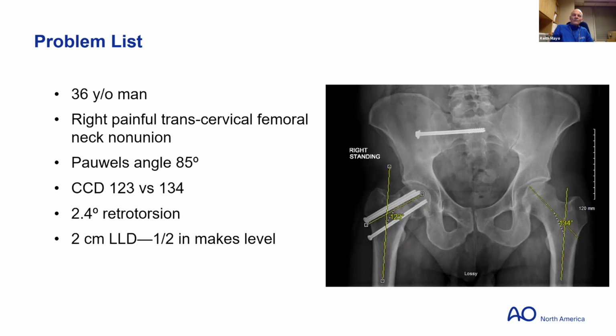The problem is that with that metaphyseal prominence, in order to get that out, if you look at his acetabular version, he has a relatively normal one. He has a positive posterior wall sign, so he's either got borderline dysplasia or I can't really tell for sure what's going on, but he's basically going to have problems with impingement unless you overcorrect in the horizontal plane on the femoral side.